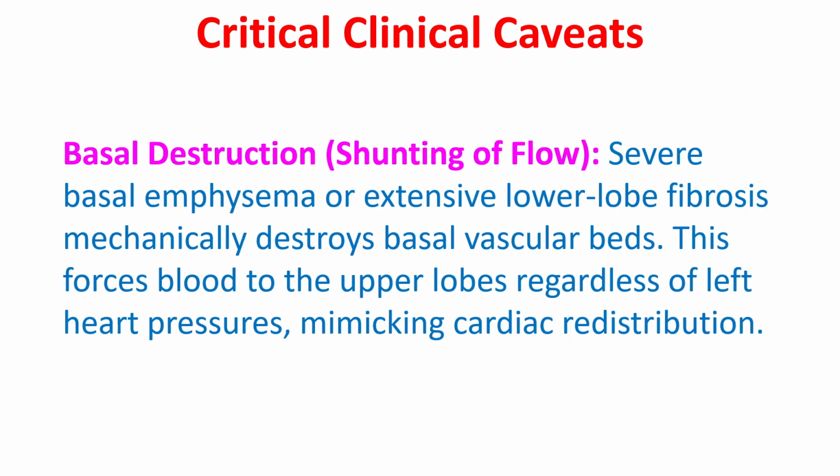Basal destruction, shunting of flow. Severe basal emphysema or extensive lower lobe fibrosis mechanically destroys basal vascular beds. This forces blood to the upper lobes regardless of left heart pressures, mimicking cardiac redistribution.